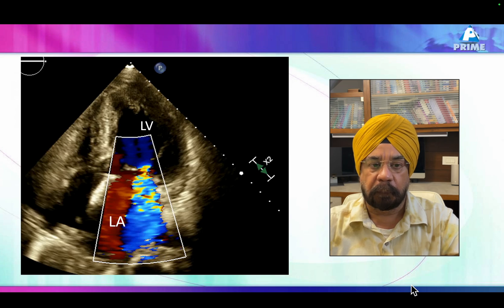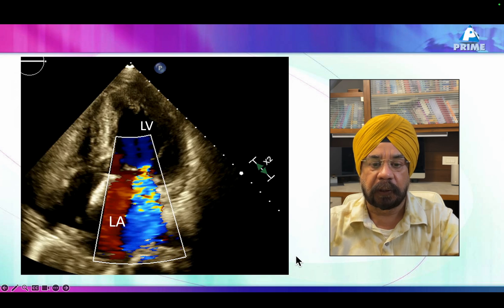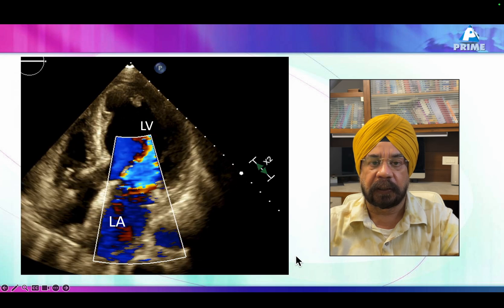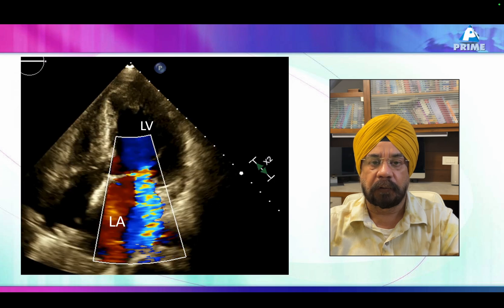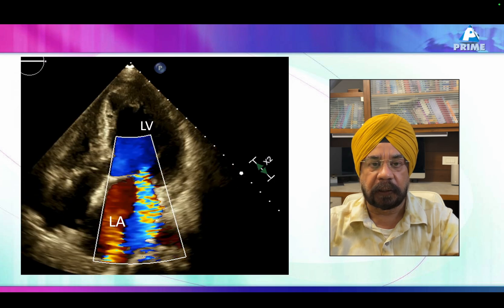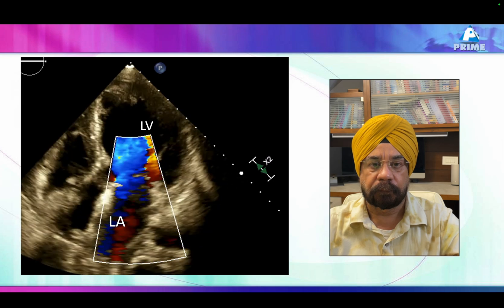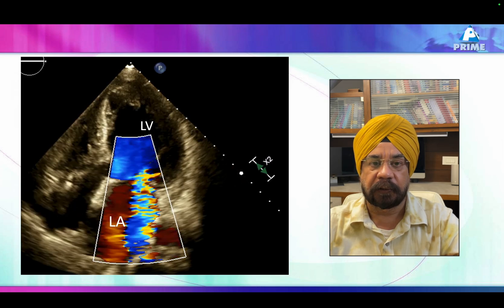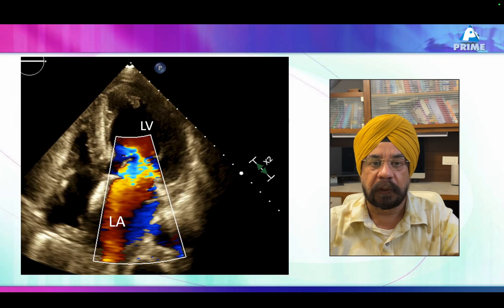This is a case we did a couple of days back. The patient had regional wall motion abnormalities, was hypertensive, had left ventricular hypertrophy, and there was mitral regurgitation. Look at the mitral regurgitation — what is your impression? Do you think that mitral regurgitation is severe? All right, let's find out whether the mitral regurgitation was severe, mild, or moderate.